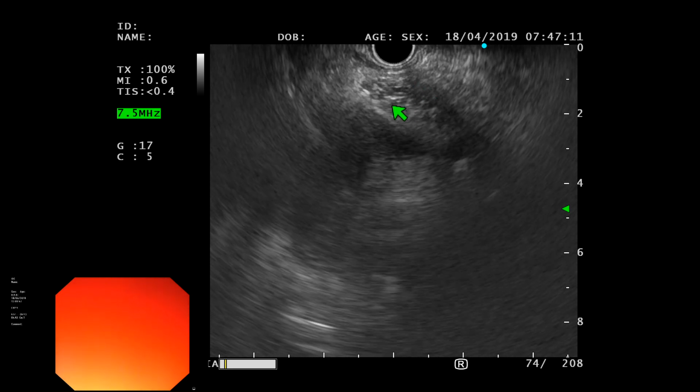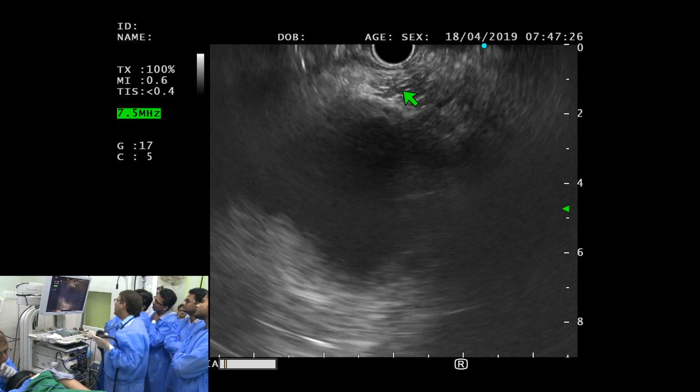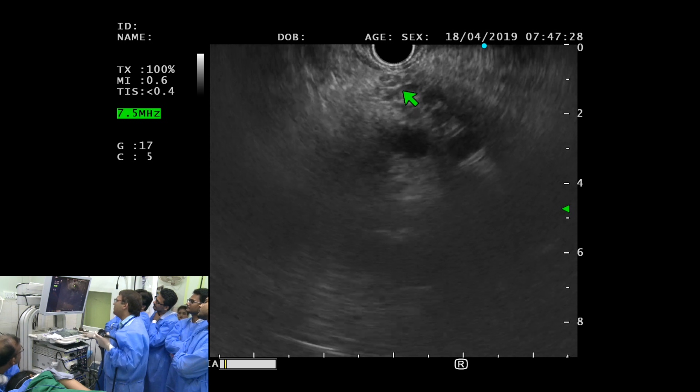Right here, this is the boundary of the pancreas. You see a little bit of lobulation there, and you see foci and strands. So she does have features of chronic pancreatitis on top of that. Here you see the duct, right in the center. Hypoechoic as well, isn't it? Yeah, those are mainly lobules.